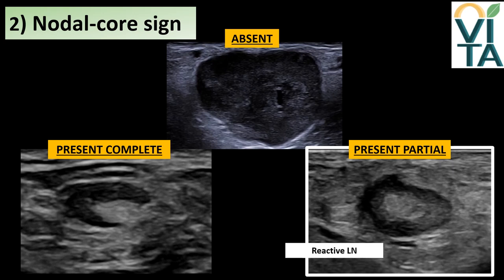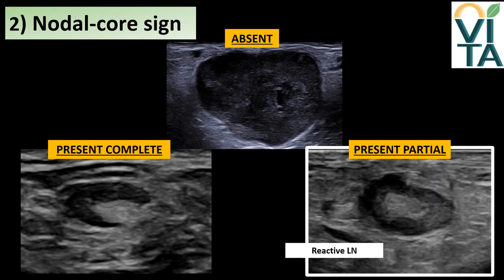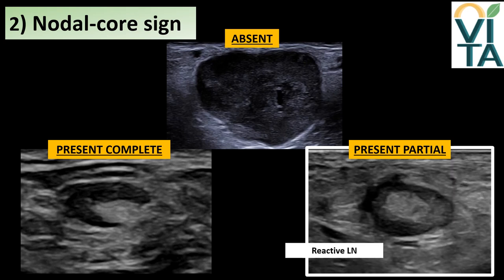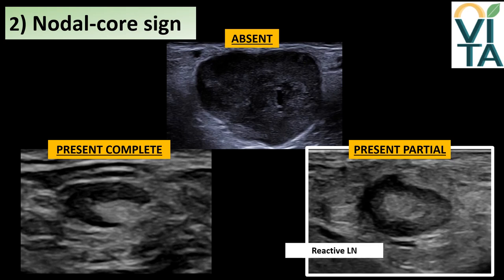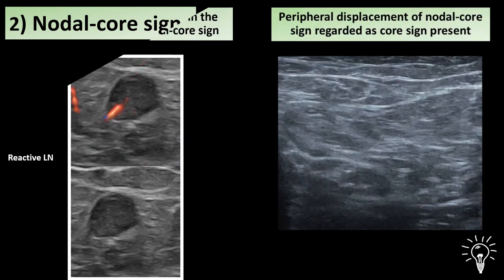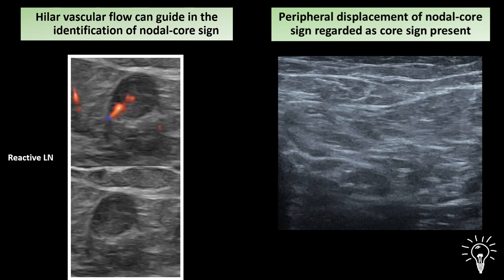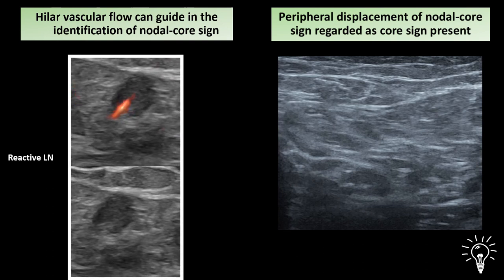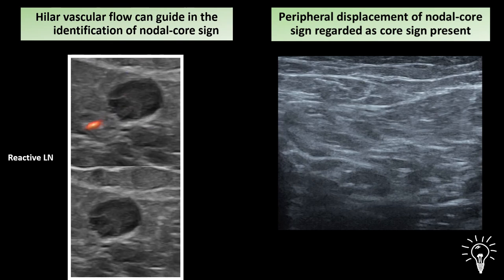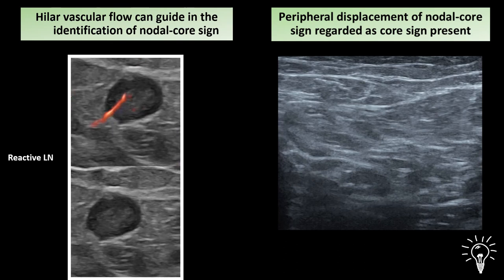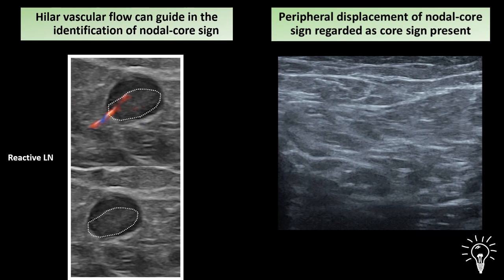In particular, on the right, thickening of the hypoechogenic cortex due to a reactive process has compressed the hilum, generating a partial nodal core sign. Sometimes identification of the nodal core sign can be challenging. In these cases, color assessment can be helpful — for instance, the longitudinal hilar vessel can guide you to the potential place of the nodal core sign, as seen in the dotted circle around the medulla.